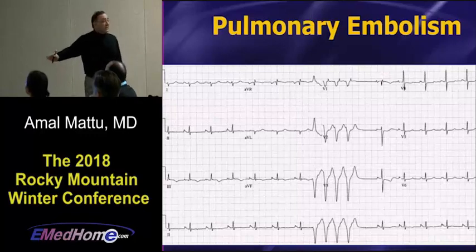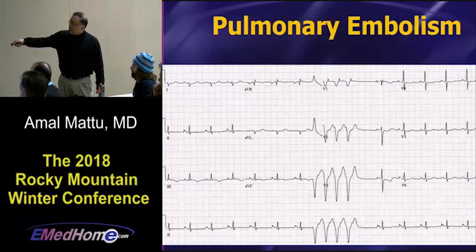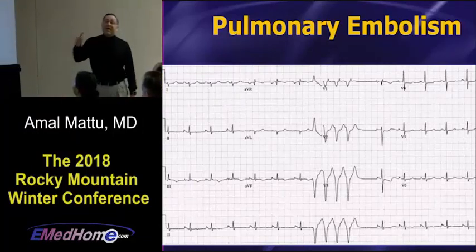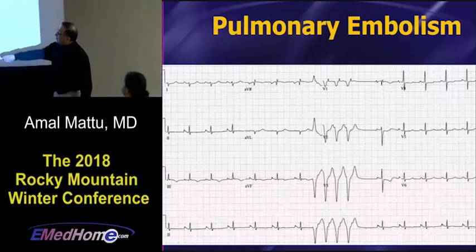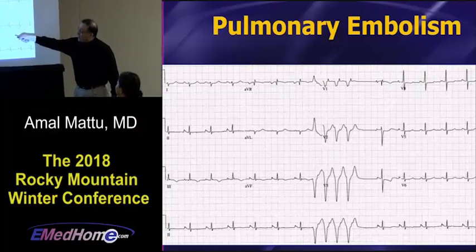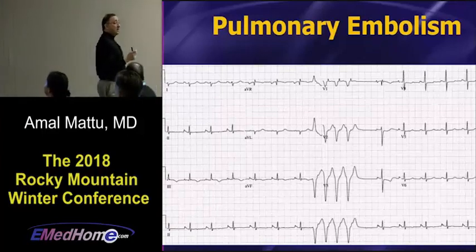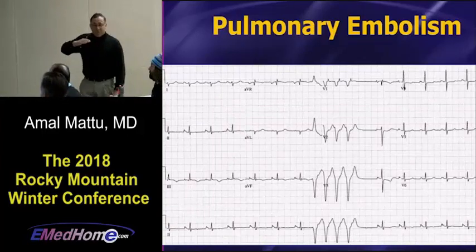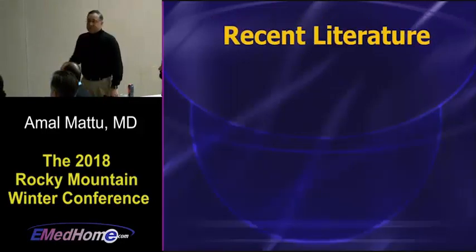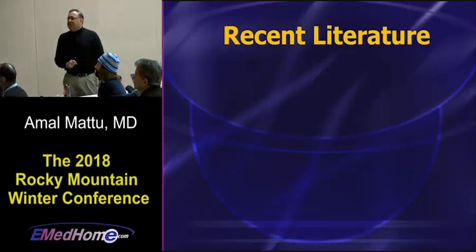And this is a great case that had a lot of people fooled. Take a look. Everyone's focusing, I'm sure, on the little intermittent run of VTach, non-sustained ventricular tachycardia, but what was not noticed was T-wave inversions in the inferior leads, 3 and AVF, and the anteroseptal leads. This was a big PE that was producing the intermittent runs of VTach. Lidocaine was given, got rid of the PVCs, not the PE though, and fortunately they ended up making the diagnosis here. So please bear in mind, as an aside, T-wave inversions are very common in large cases of PE.